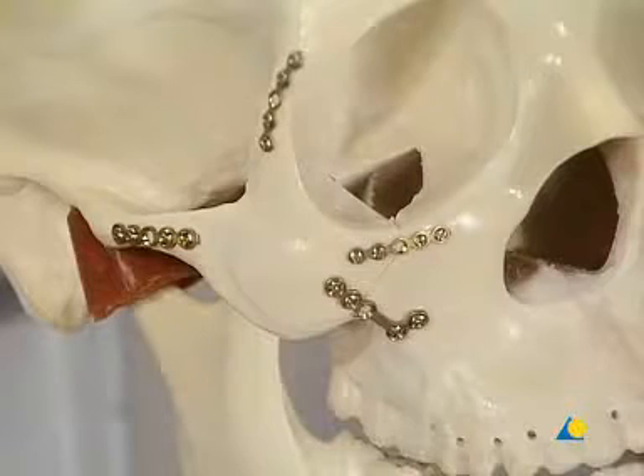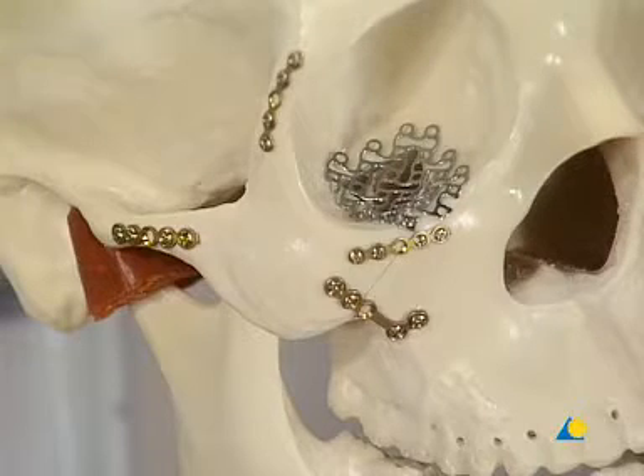A 1.3 mesh also could be selected to fix the orbital floor defect. The mesh is trimmed and contoured to meet the proper anatomical features, and enough screw holes should remain on the plate for proper fixation to the infraorbital rim. In cases of severe dislocation, multi-fragmentation, and instability, a four-point fixation with additional plates at the zygomatic arch and infraorbital rim may be indicated.